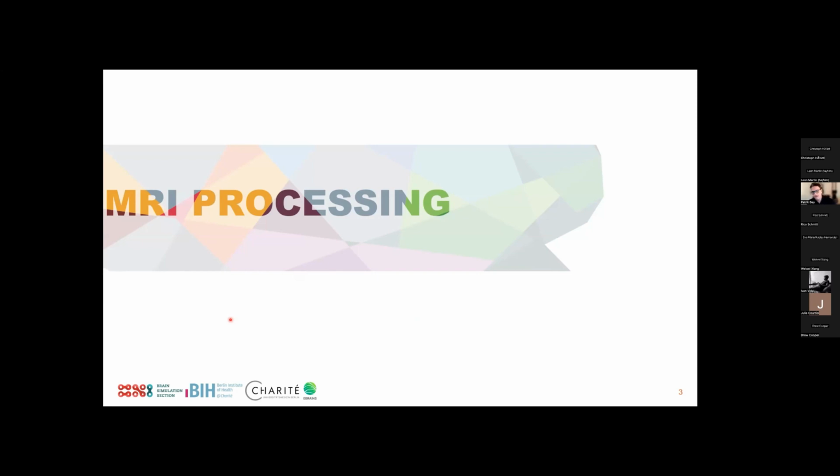But we're going to go through a somewhat high-level description of some of those steps and how they actually influence processing. We will have, I hesitate calling this a hands-on session, at the end, but I will go through some code that I also shared with you, to maybe give a better understanding if some of you are totally new to actual MRI processing. So we will do this at the end as well, but first we want to go through some of these descriptions, which is going to be the main part of the lecture today.